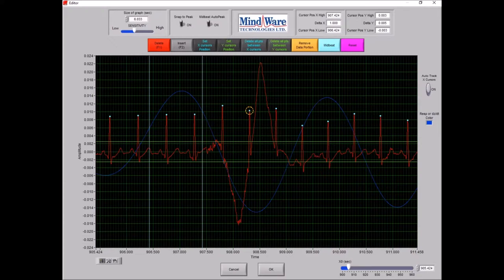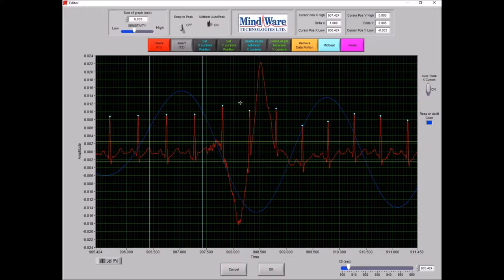There's another way to insert a peak: turning snap-to-peak off, which inserts a peak exactly where you click regardless of whether it's on the signal. This is useful when there's so much noise around a suspected R peak that you can't get your circle small enough to capture only that one peak. You can use that crosshair tool and click exactly where you see the R peak. But generally, if you can see the R peak, you should use snap-to-peak so the application picks the best peak.